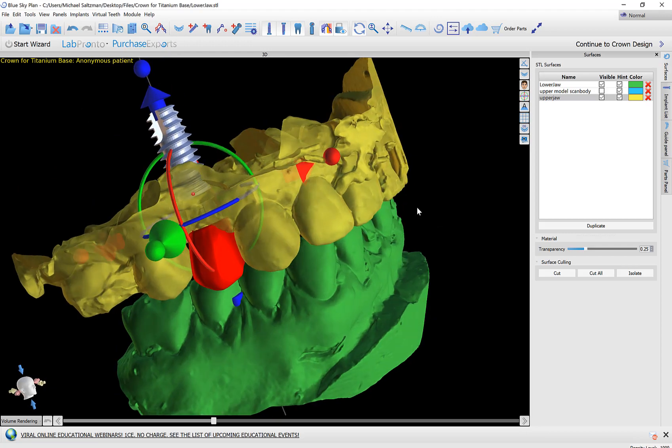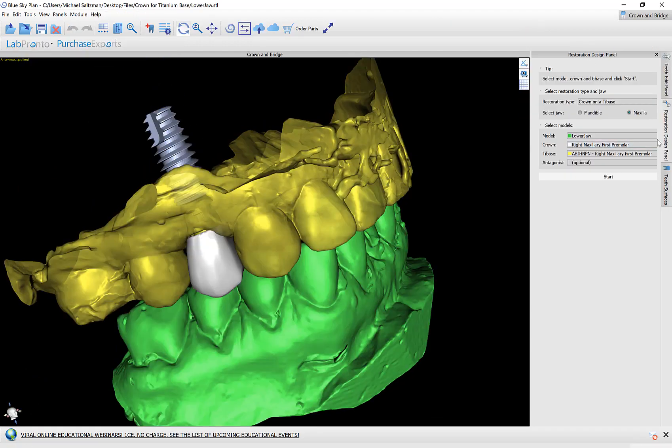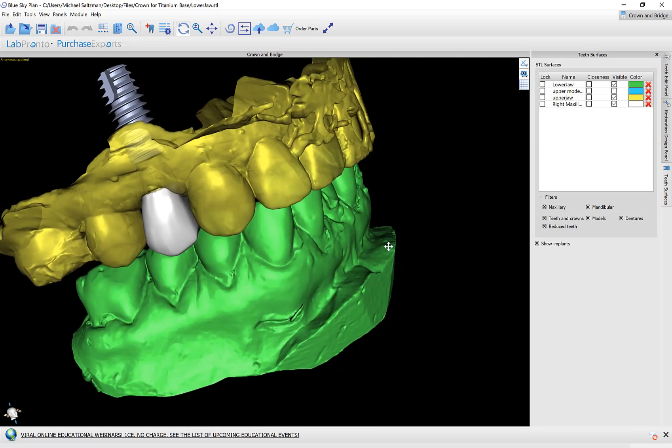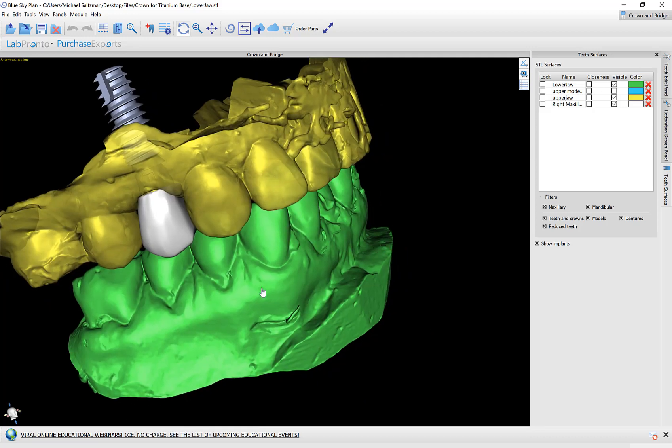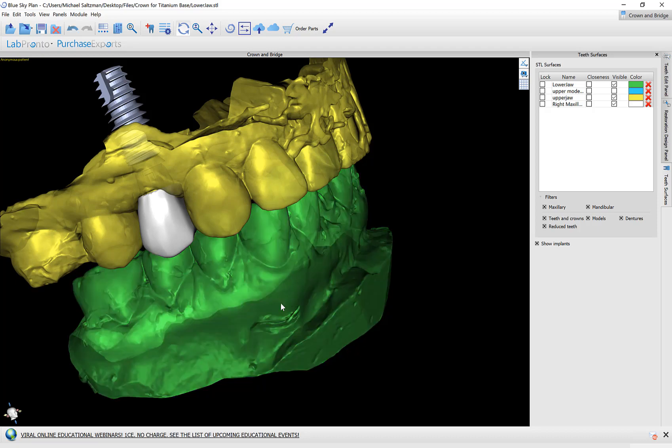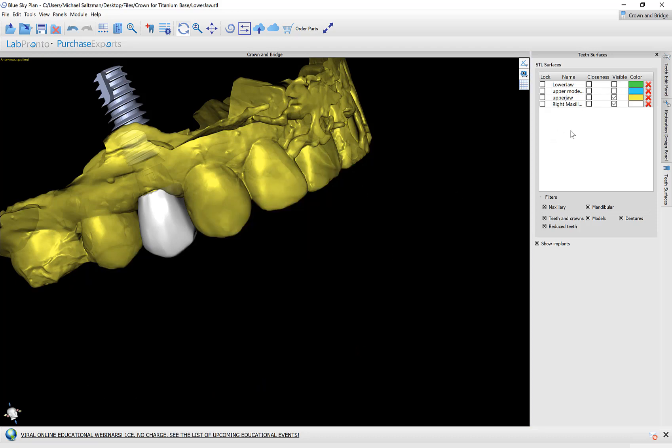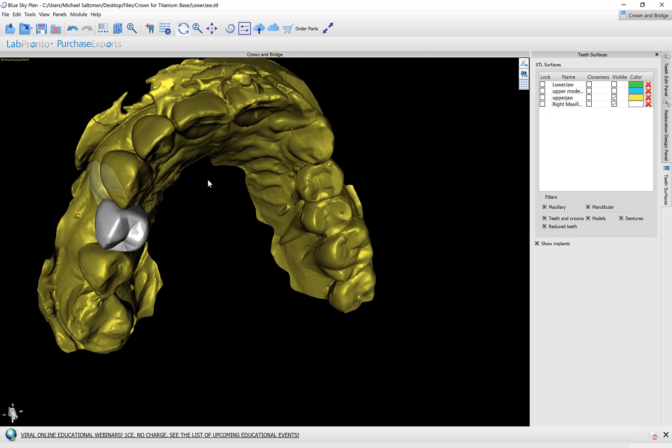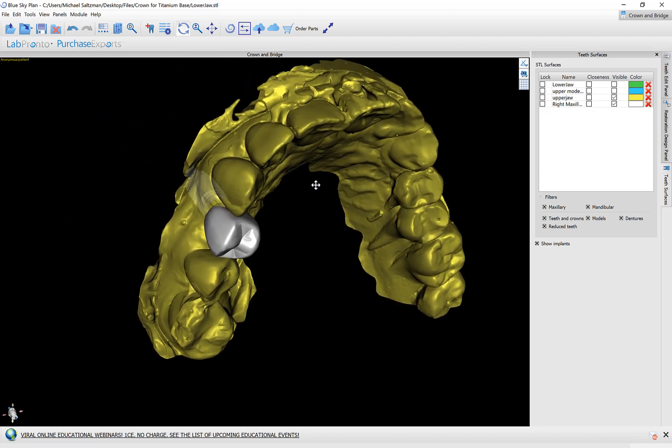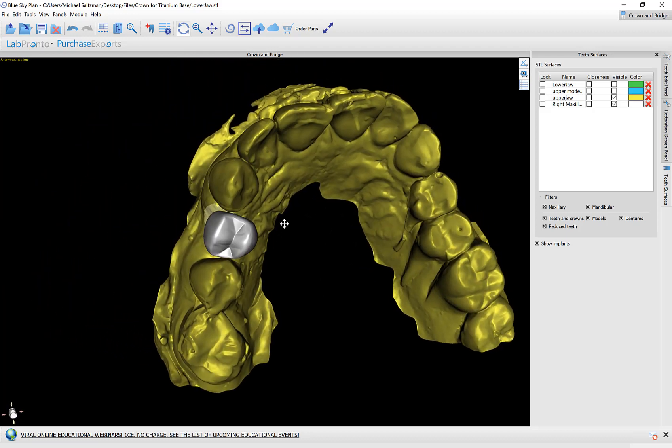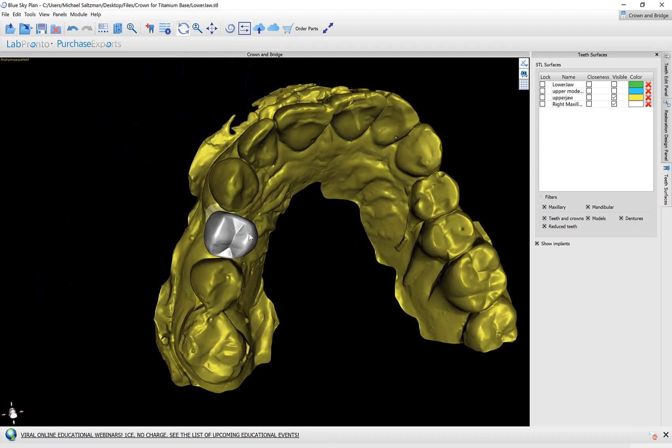At this point if we want we could go ahead and make some general improvements to the positioning and or the size of the crown. But during the process flow later the software will take us through that. So there's no need to get hung up on it at this point. I'm going to proceed by clicking on continue to crown design.